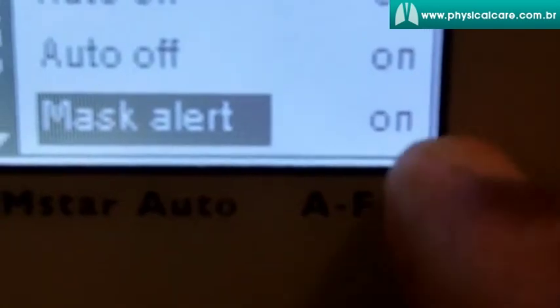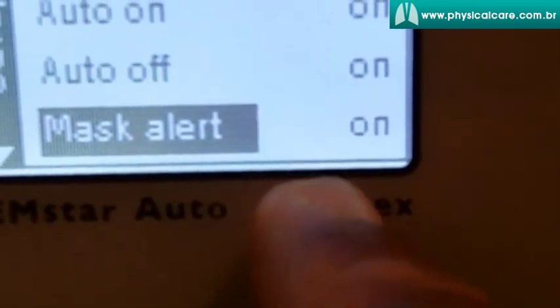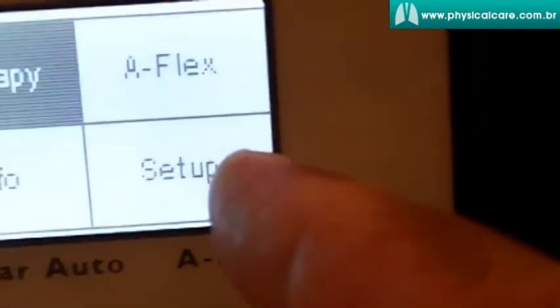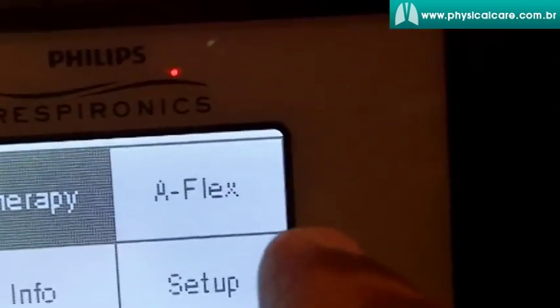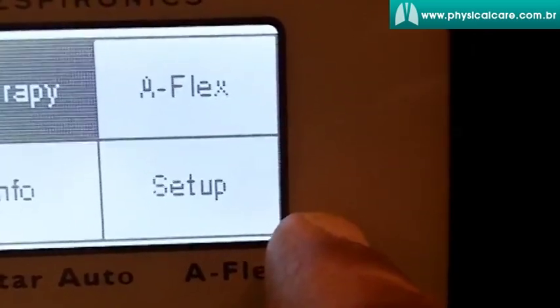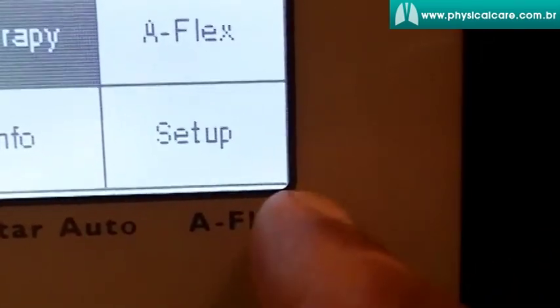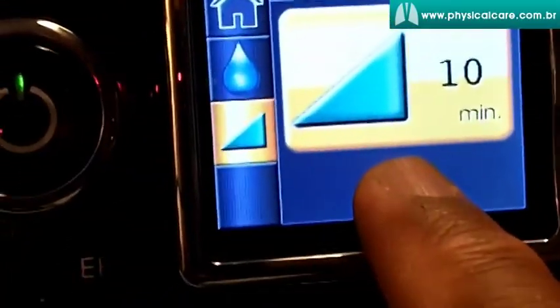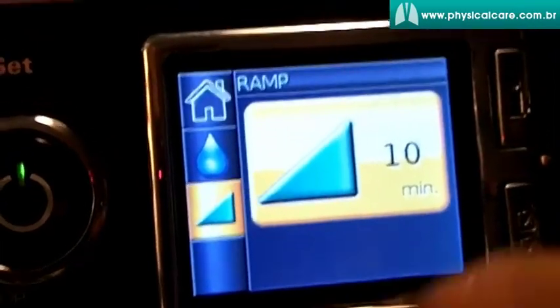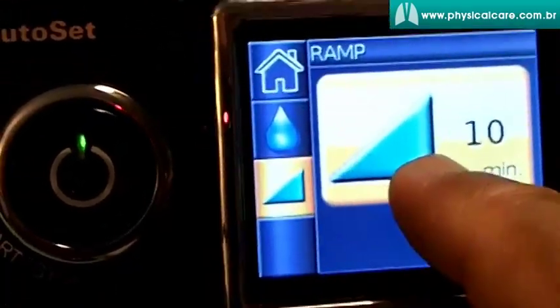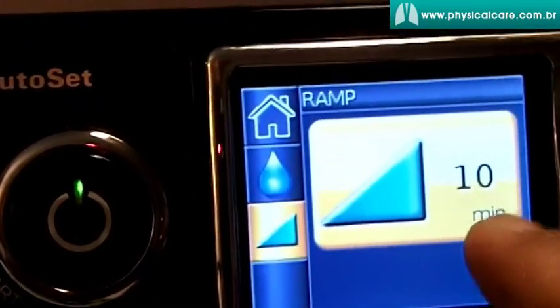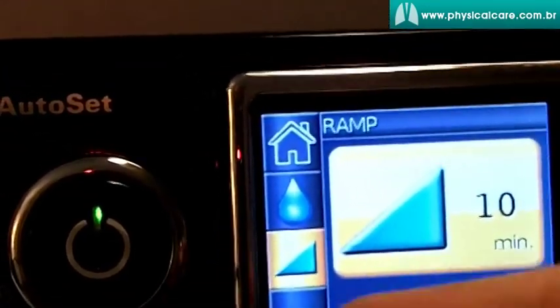Mask alert — if you turn it on, that means if there is a large leak in your CPAP mask, there is a beeping sound that tells you. This is very useful for you to wake up and fix your mask, or if you're using this on a pediatric patient, it's good for parents to know there's a leak in the system. In ResMed, there's no sound, but on the screen it will indicate there's a leak. However, the home care company must turn that feature on for you before you receive the device.